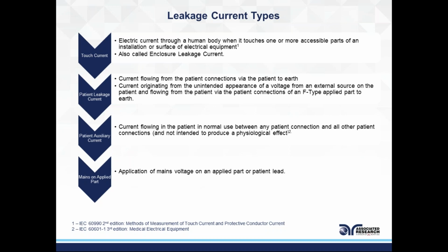So if your bed has any kind of electric motors or the thing that pushes it up and down, you have electrical signals coming into the bed. Now you want to make sure that those electrical signals don't make it onto the patient itself. So you want to protect the patient from coming in contact with any kind of live voltages that the bed may be plugged into. So patient leakage could be as simple as anything that comes in contact with the patient while they're inside a medical facility, or it could be some outpatient facility, or it could be a doctor's office.